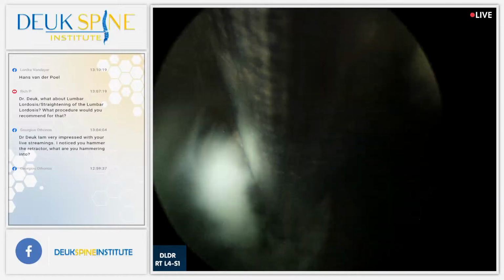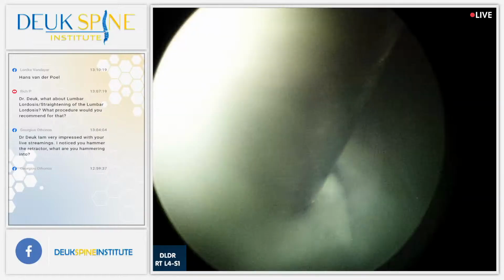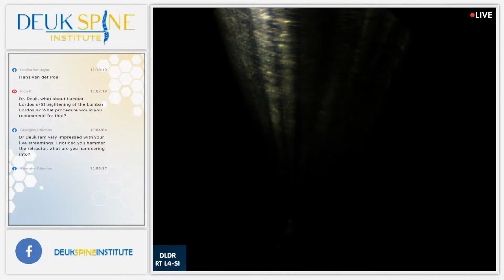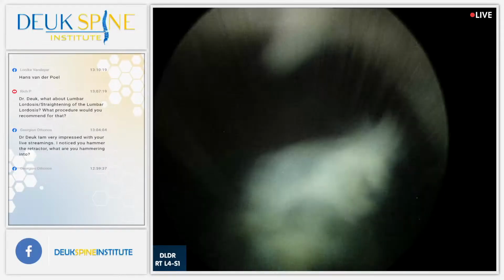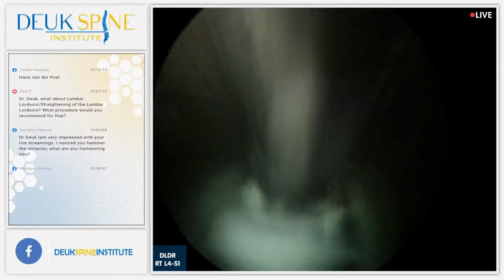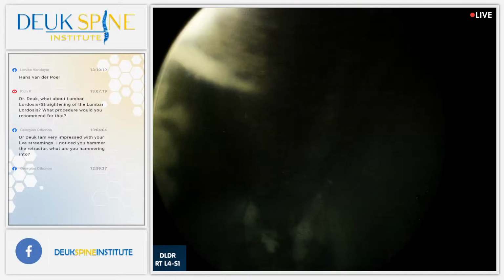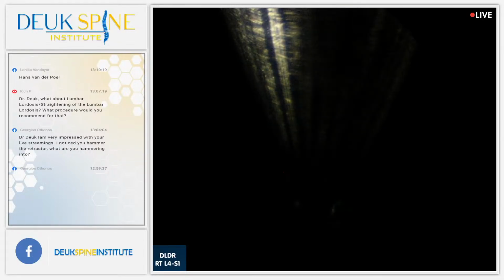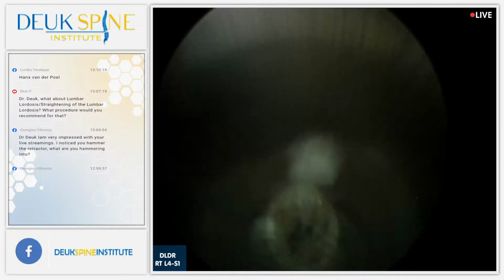There's a reason why you have a flat back deformity, and it's because your nerve roots are being pinched from spinal stenosis. Then I would do a Smith-Peterson osteotomy. Then I would do an interbody cage and reconstruct your anterior column and middle column using cages as big as possible through a posterior approach, usually a T-lift.